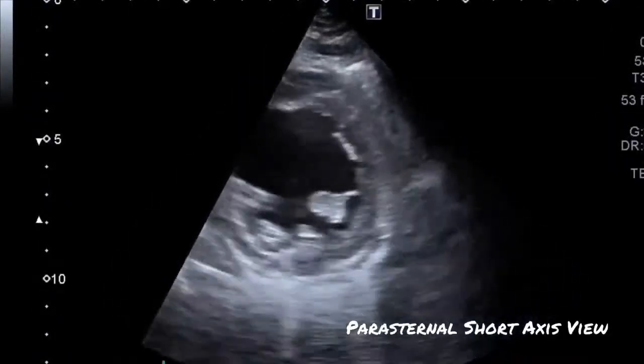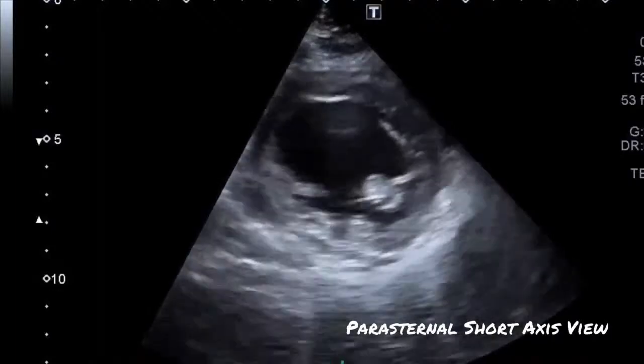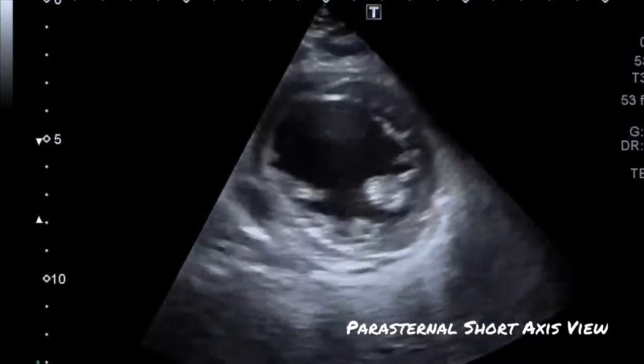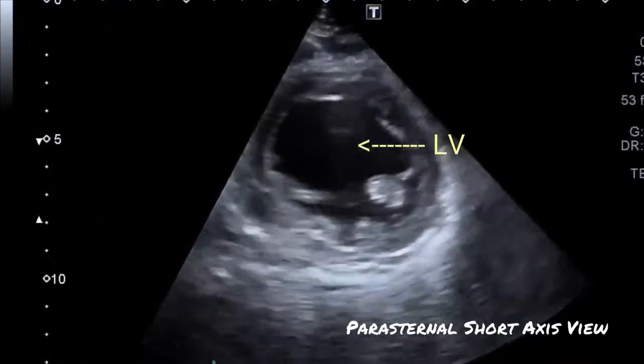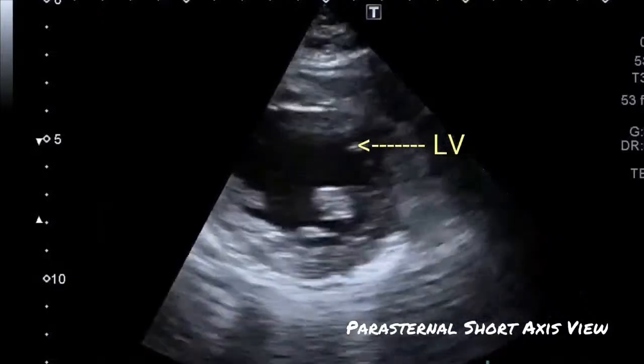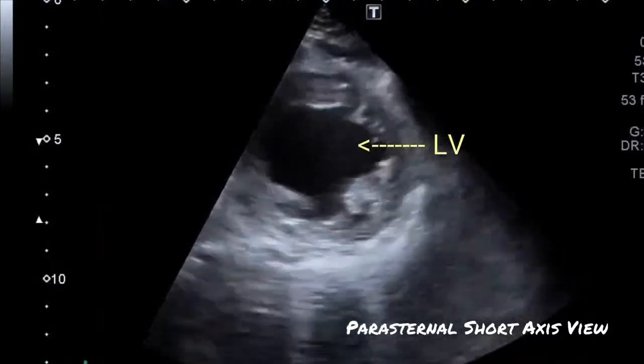And the same thing we can also appreciate in the parasternal short axis view. Here also we can clearly see a very small percentage change in chamber size from the diastole to systole, and also very little movement of the ventricular wall during the cardiac cycle.